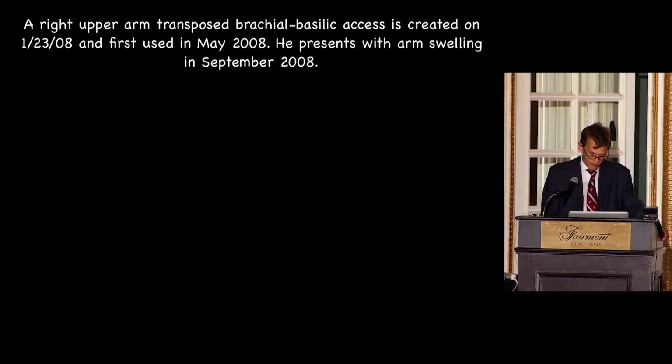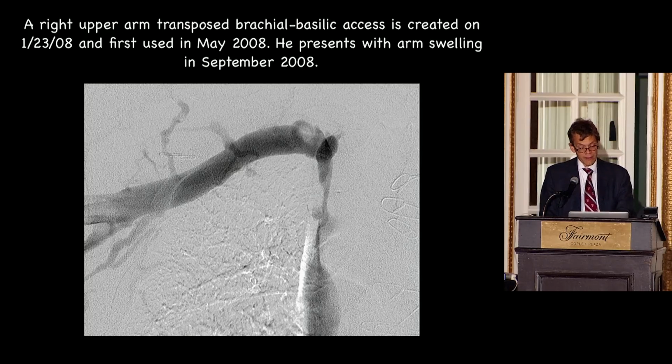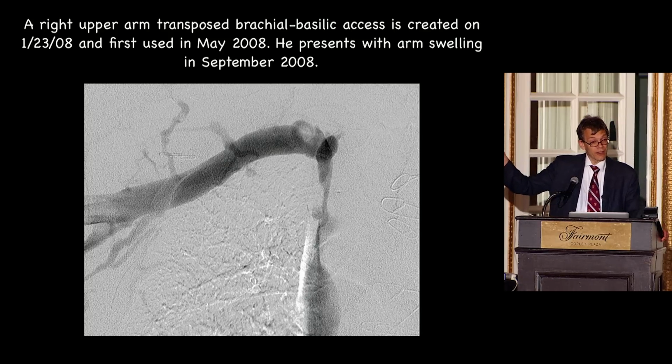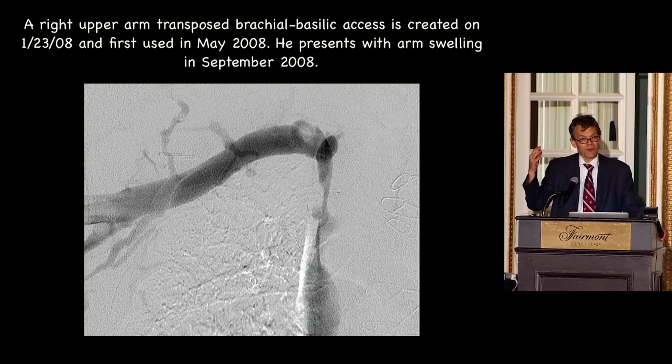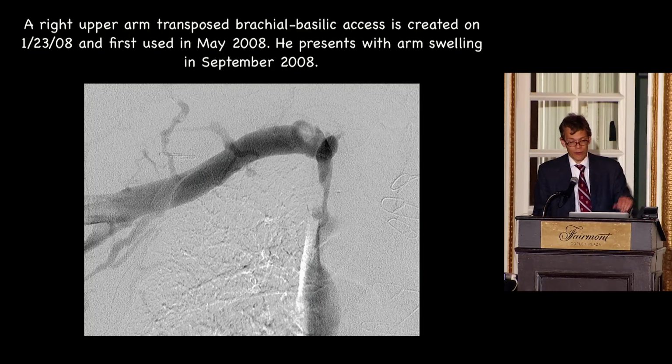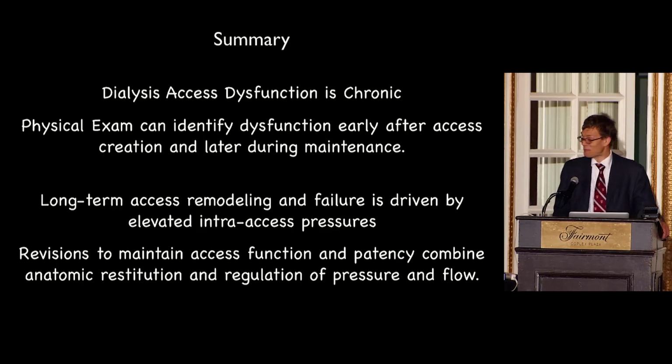So this gentleman with the catheter tip up high in the brachiocephalic vein, this is how he presents once the fistula is on his right arm. Exactly corresponding to the catheter tips, the vein has shriveled up. Yeah? So this is the concept of catheter contact time. If you leave them in for a long time, you get an effect on the vessel wall, and in some patients, this is what you get. Other patients are fine for 10 years with catheters. We all know one of those, but that's not the general message.